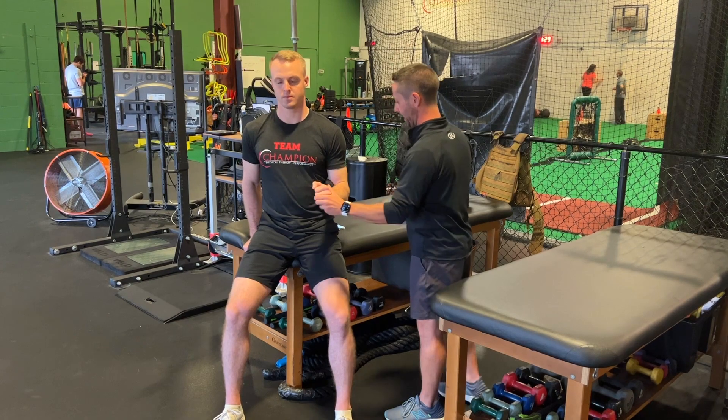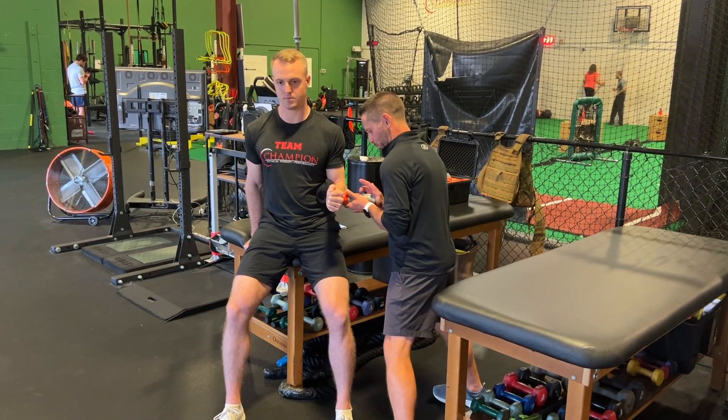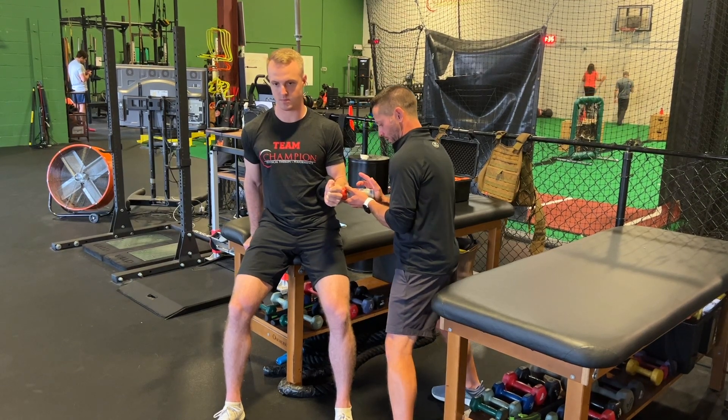Ready? Nice and tall. Face, chest, and head straight ahead. Squish that towel. Ease in, and go — push, push, push, push as hard as you can — then slow, slow, slow. Perfect.